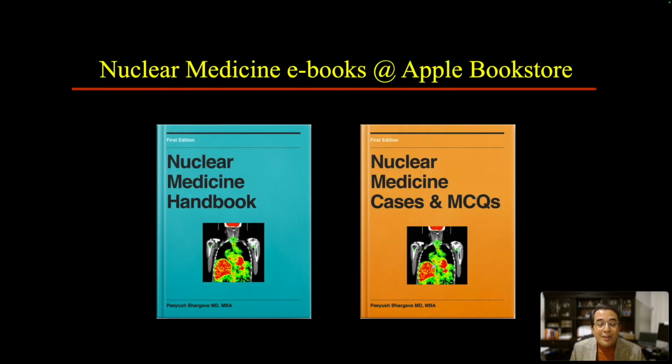All right, so this was a whirlwind tour of common artifacts and pitfalls on FDG PET CT imaging. Hope you enjoyed these cases.